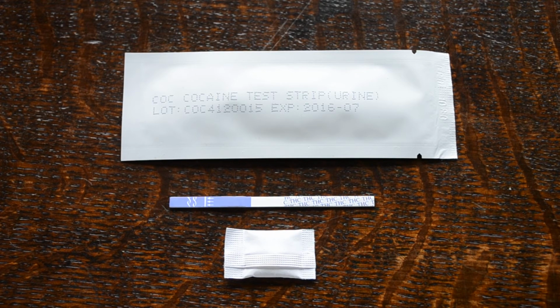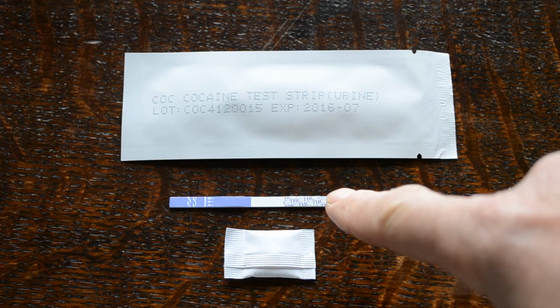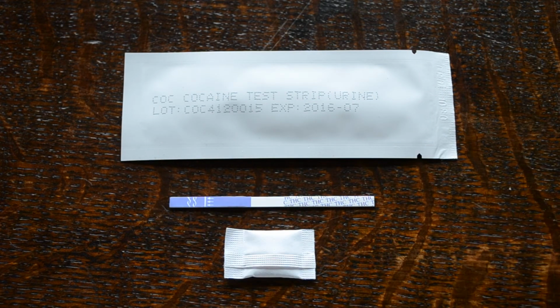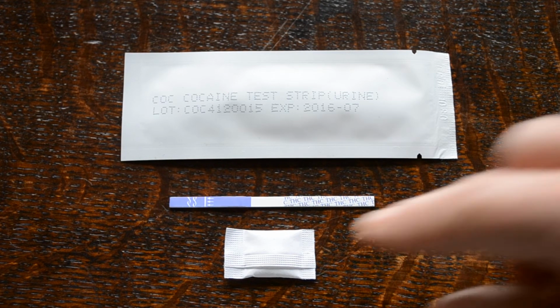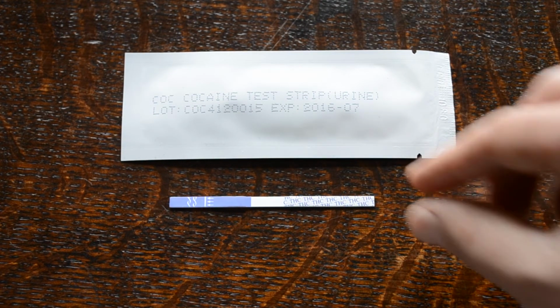And the contents of the foil pack will be a test strip in this format with a handle end, a dip end, with an indicator of the maximum dip line, and there'll also be a little pouch of desiccant. That's just to keep the test strip nice and dry in the foil, so it's got no moisture on it at all. That can be discarded as soon as you've opened the foil. You don't want to open the foil until you're ready to do the test.